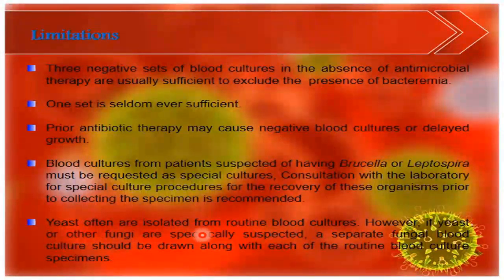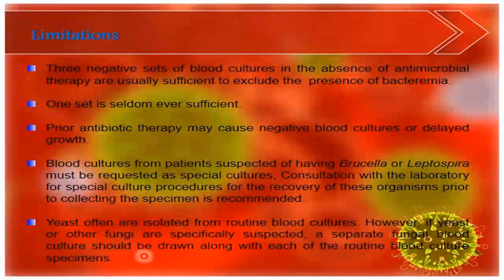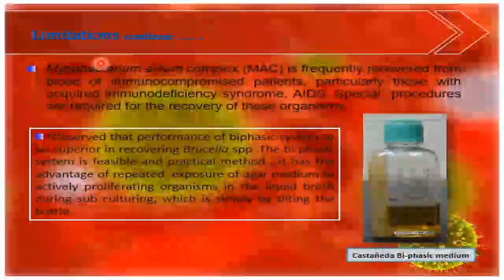Yeast often are isolated from routine blood culture. However, if yeast or other fungi are specifically suspected, a separate fungal blood culture should be drawn along with each of the routine blood culture specimens. All of these are limitations for blood culture. Okay.